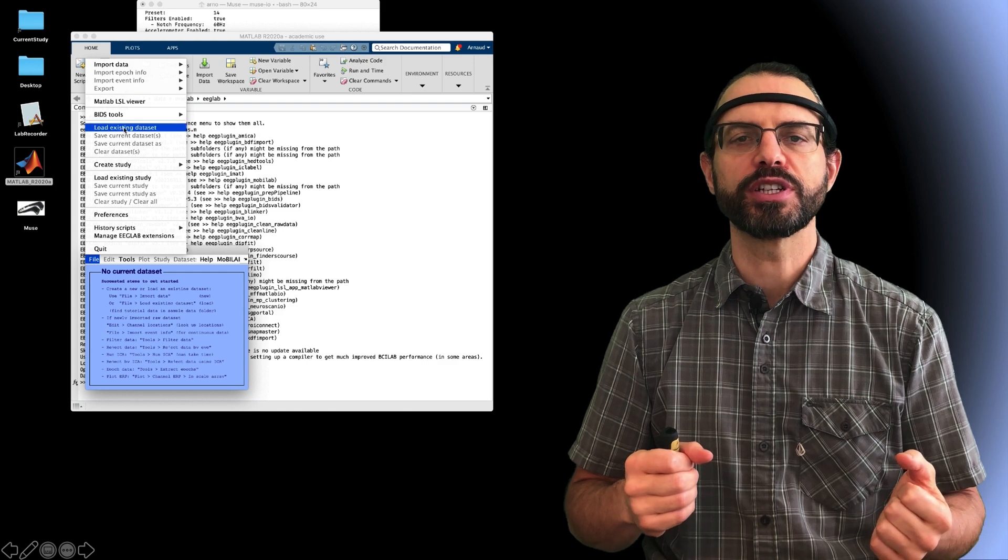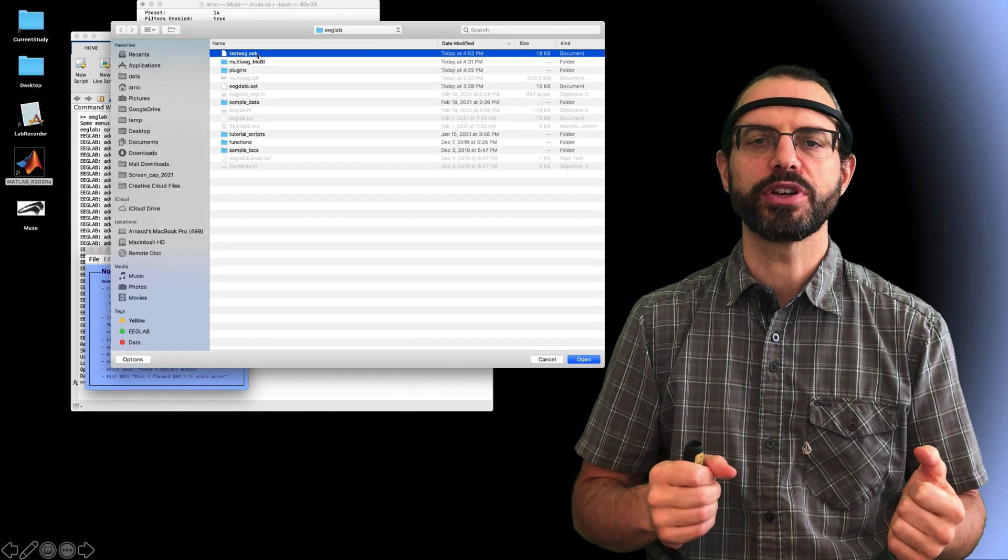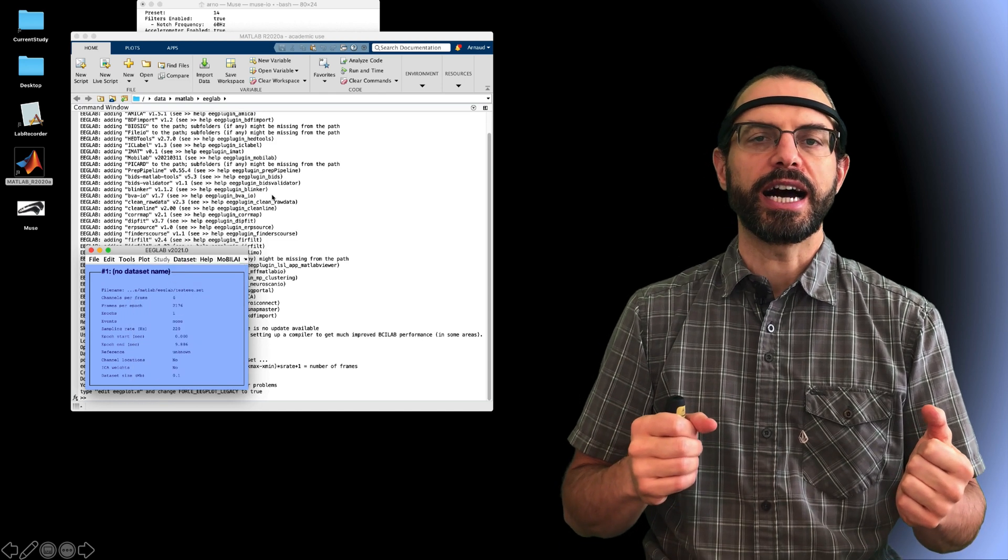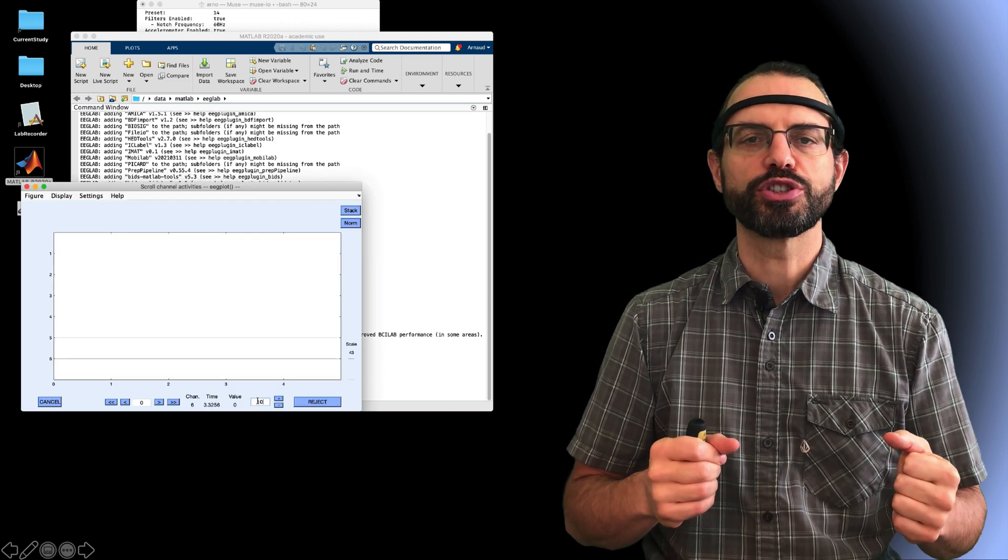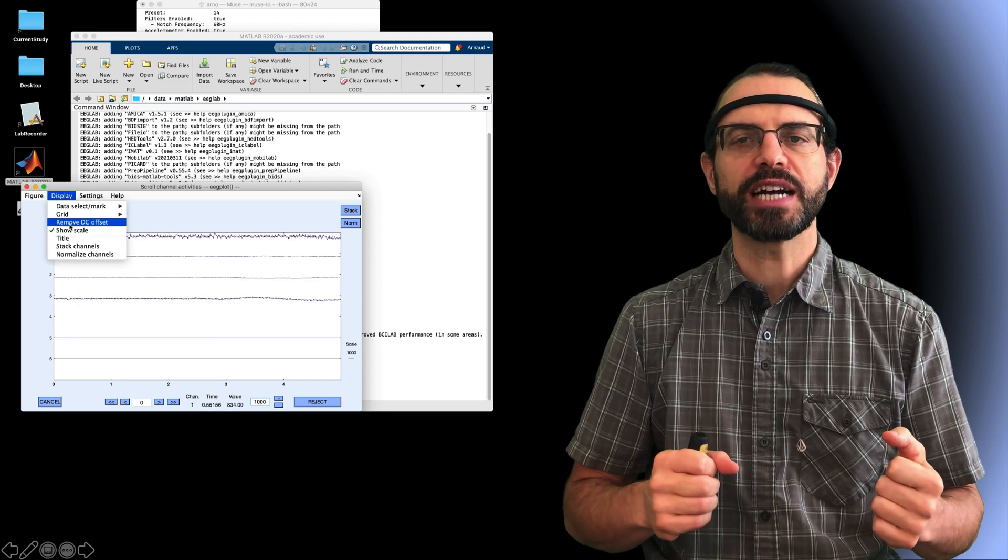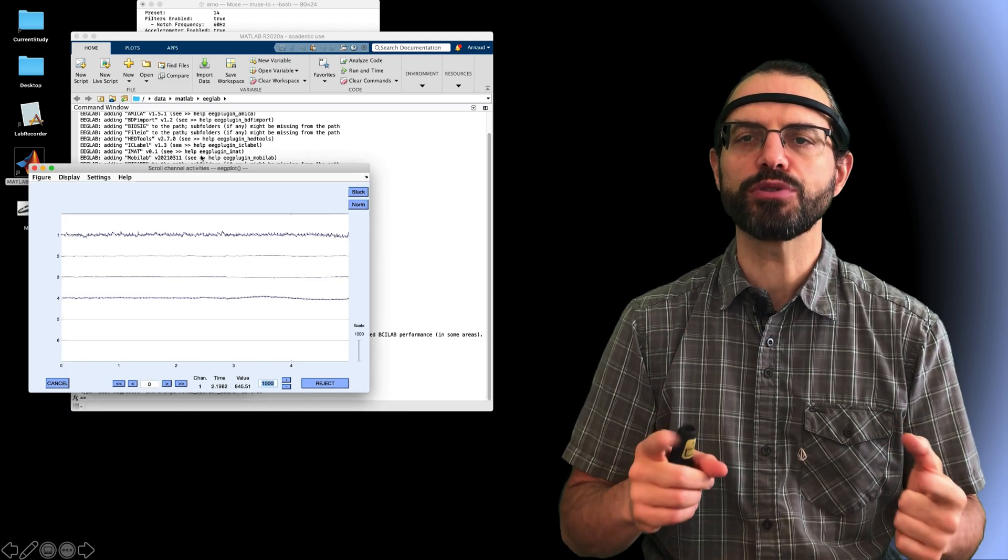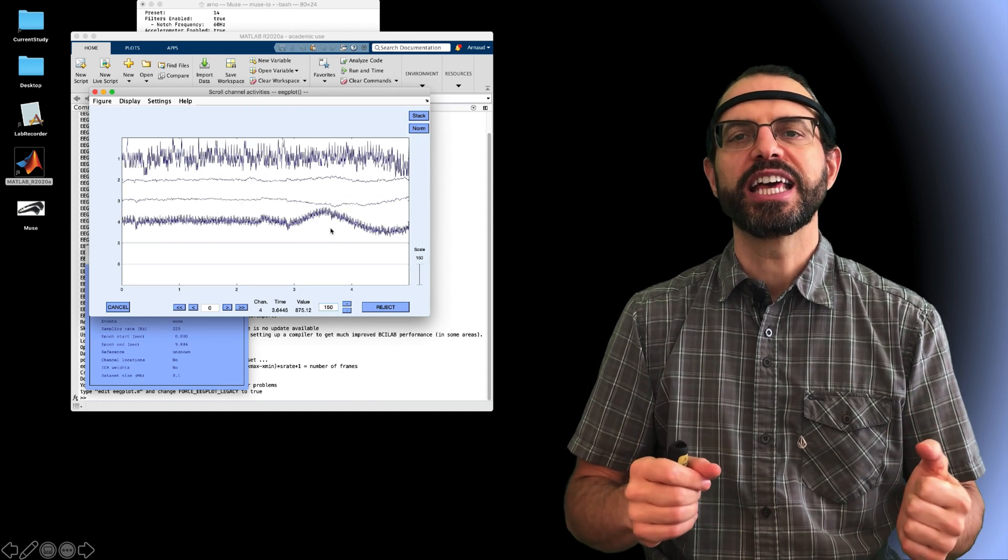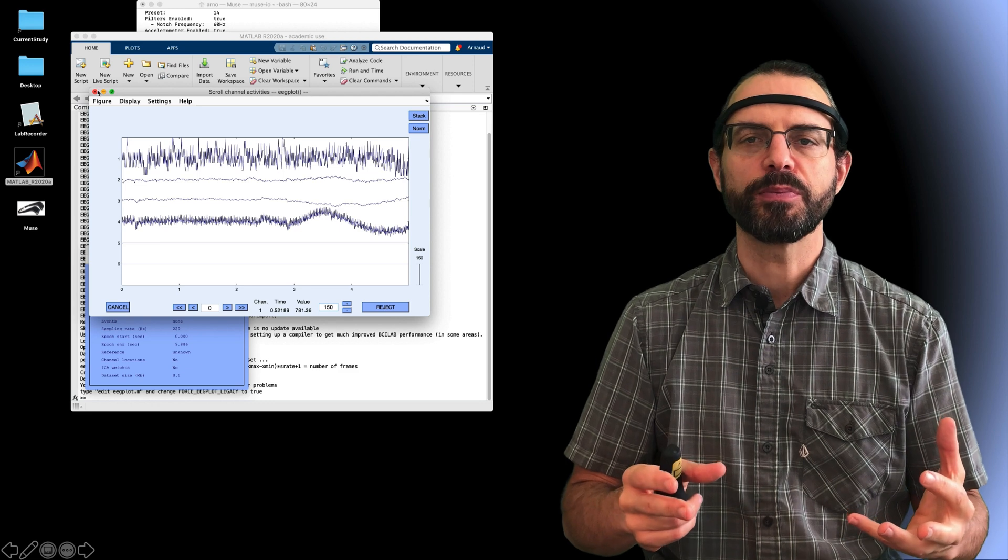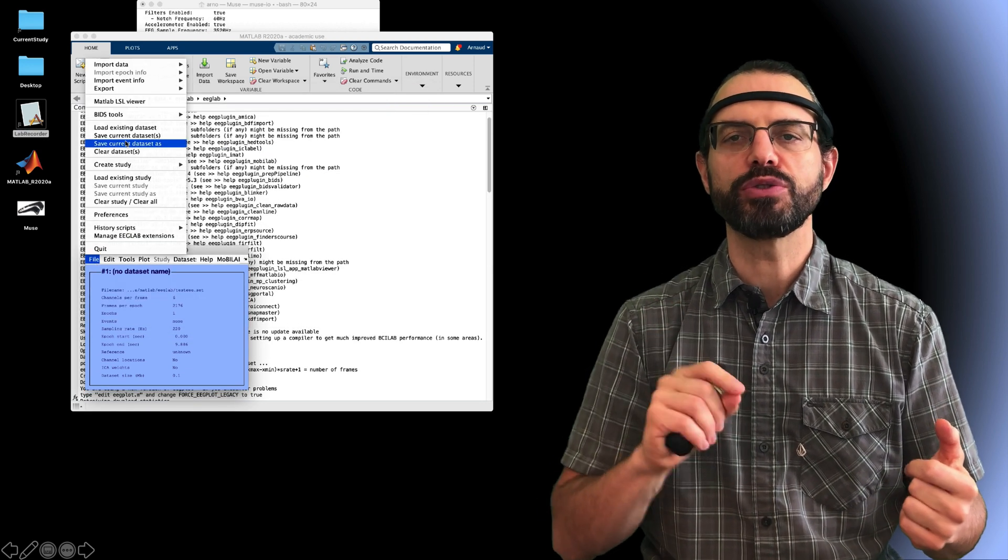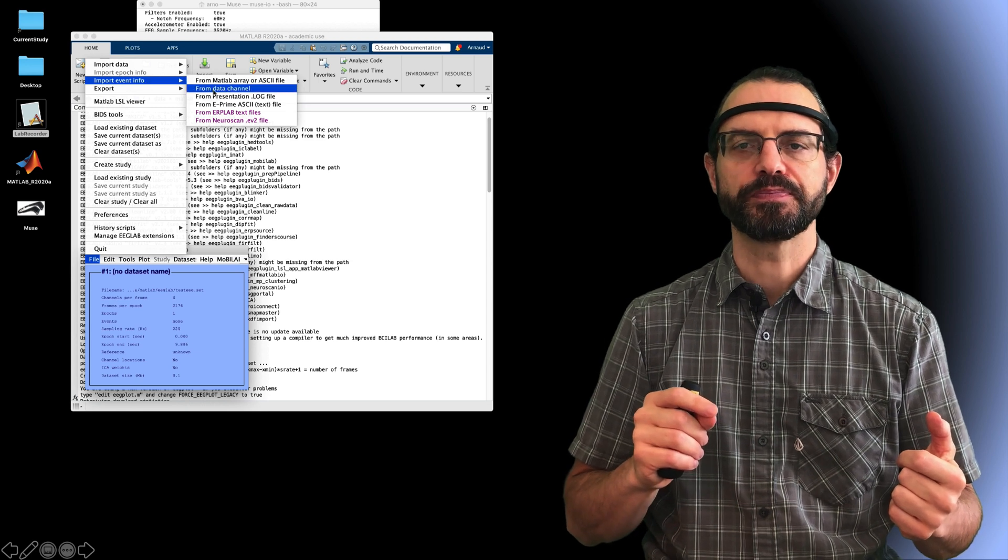And I now have a regular EEGLAB dataset that I can use as I would any other EEGLAB dataset. First, I'm going to load it and then I'm going to plot it. I need to change the scaling and also remove the DC offset. Sometimes you might have the last EEG channel containing event markers. It's not the case here. If I had an event channel, I can use this EEGLAB menu to import events.